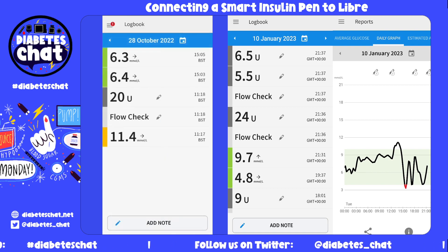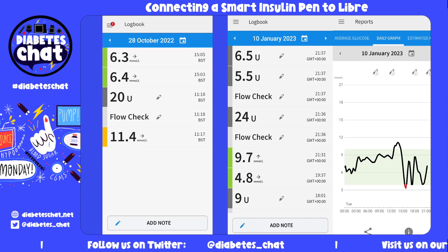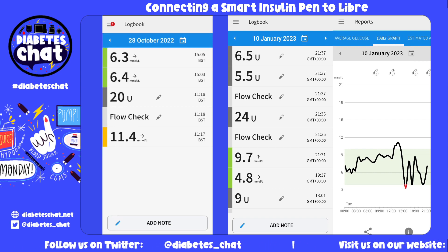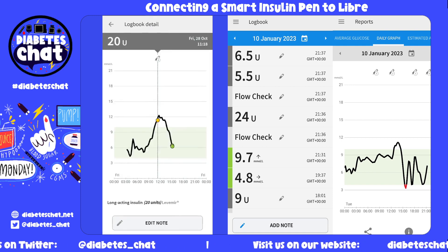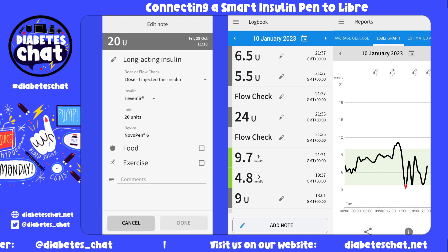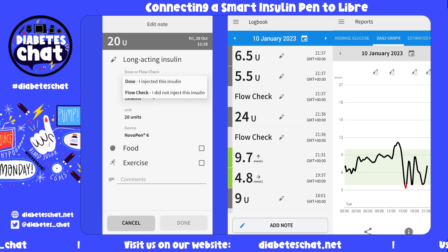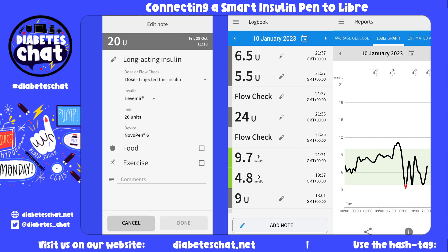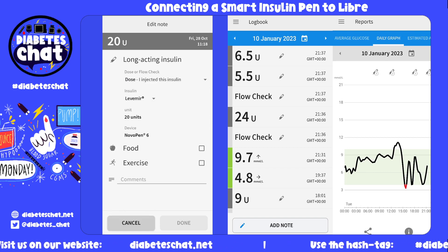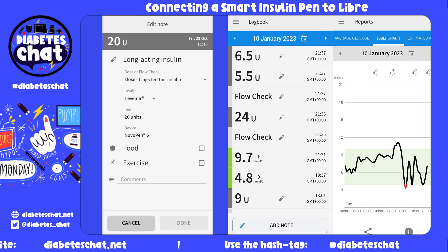If we go back to that screen, it has now updated and you can see the flow check — the air shot is there. If I want to update the 20-unit, you can click on that, press edit note, and I can change the dose or flow check to 'injected this insulin' because you gave yourself the 20 units. Again, you can add some more notes in there if you want to.